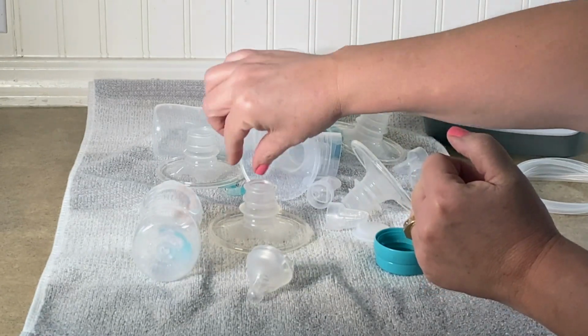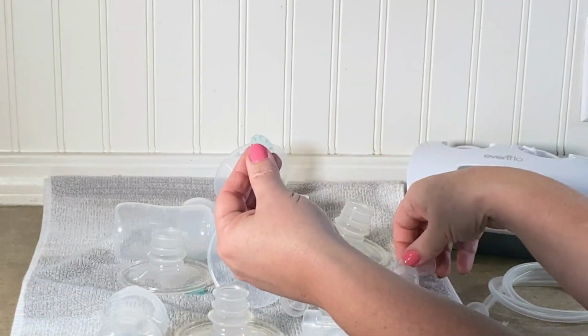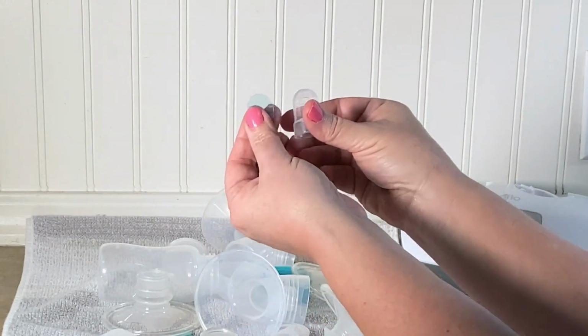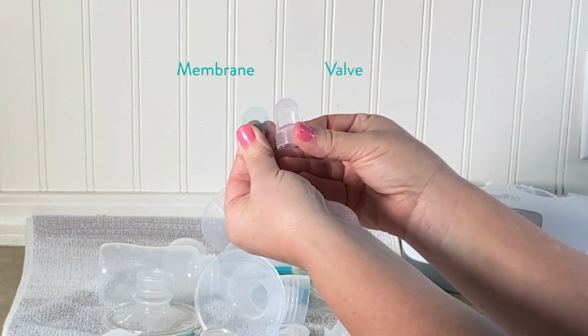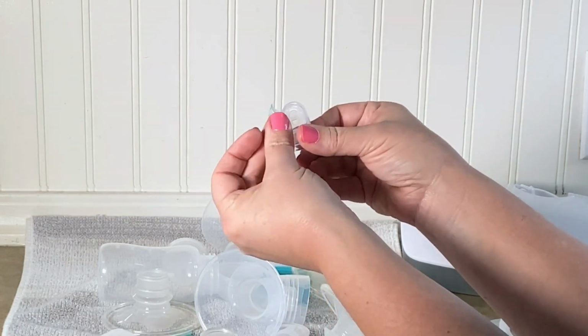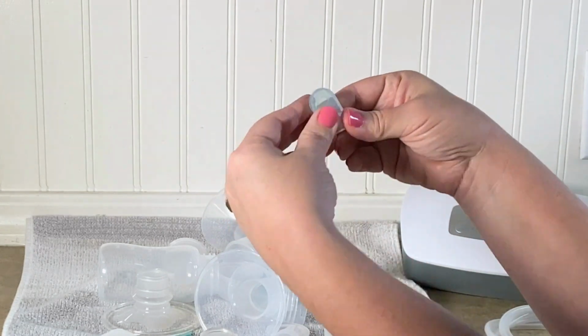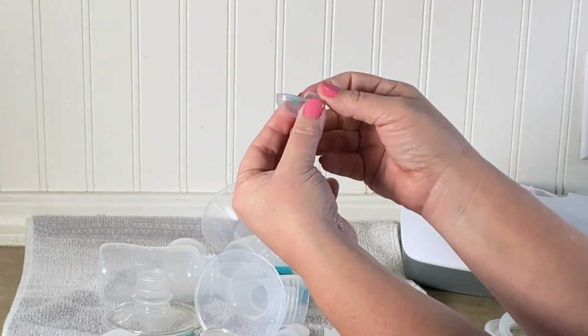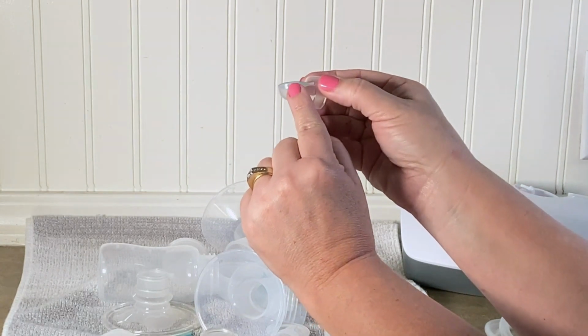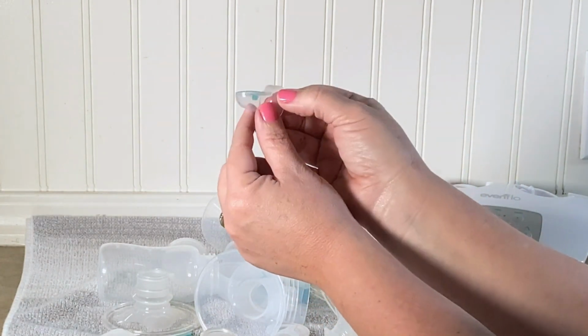I like to start with the valves and the membrane, so let's find a green membrane and the little valve that it snaps onto. You'll notice with these pieces that both of them have a rounded edge. You're going to want to line up these pieces so the rounded edge is facing the same direction, and then you can snap the membrane onto the valve. After you put it together, take a minute to inspect the edges. The membrane should be laying flat against the valve.